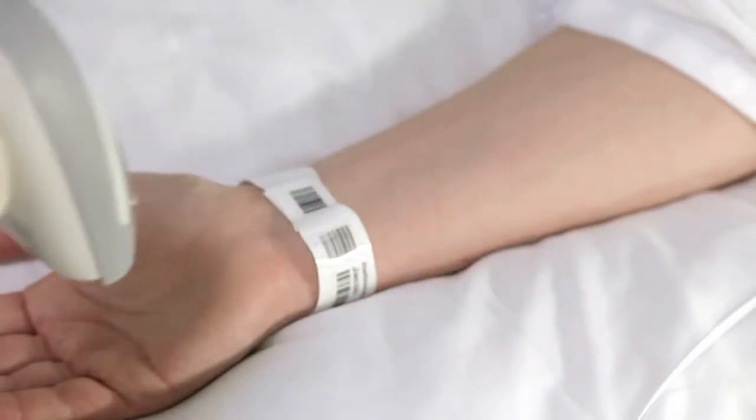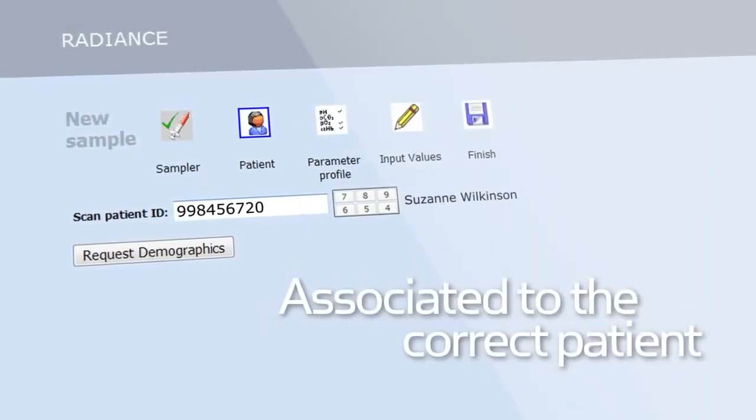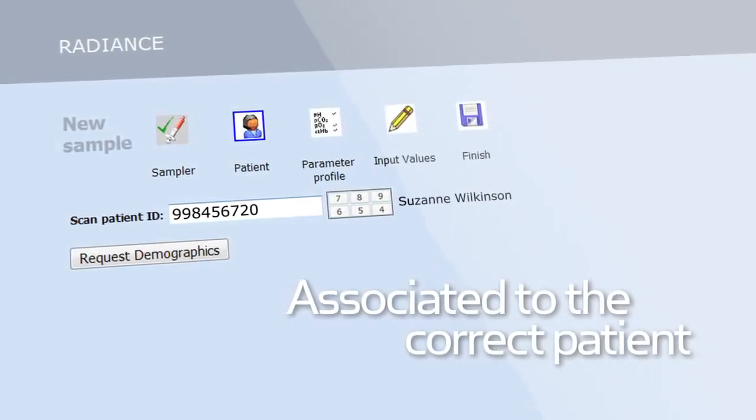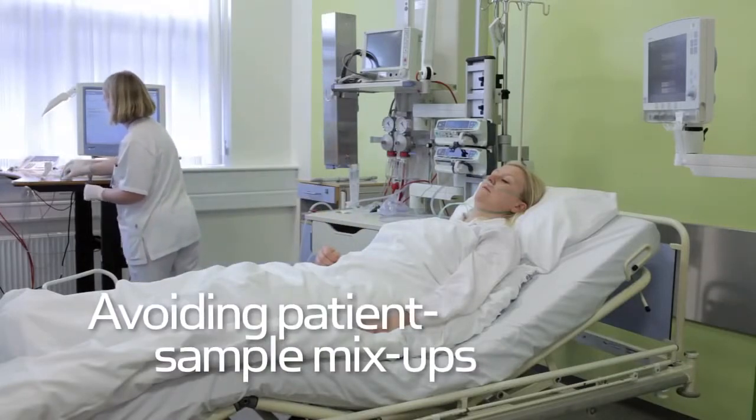Patient demographics are displayed on the screen, so you can make sure that the sample is associated to the correct patient. Patient, sampler, and operator IDs are linked together at the bedside, avoiding patient sample mix-ups.